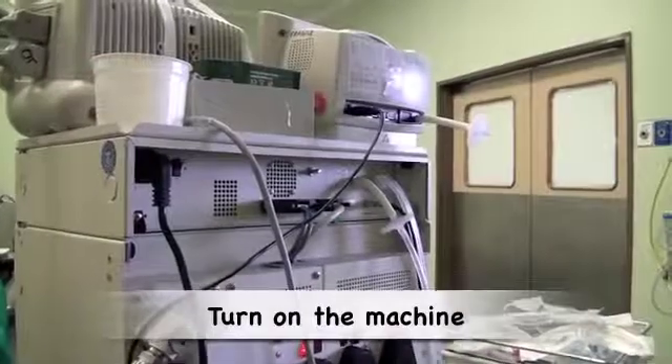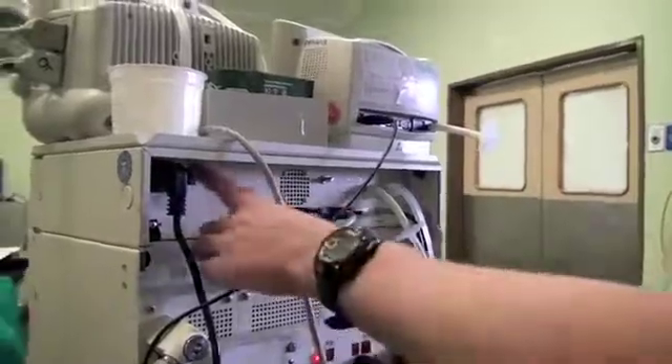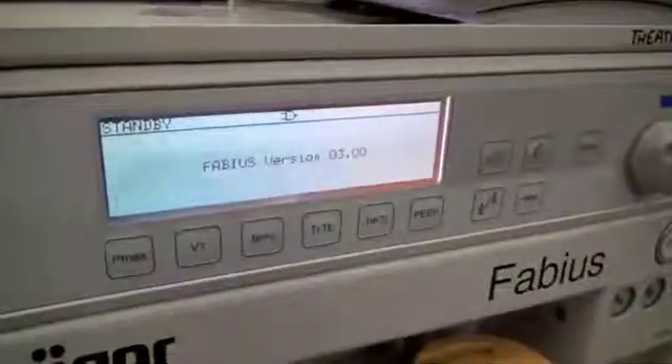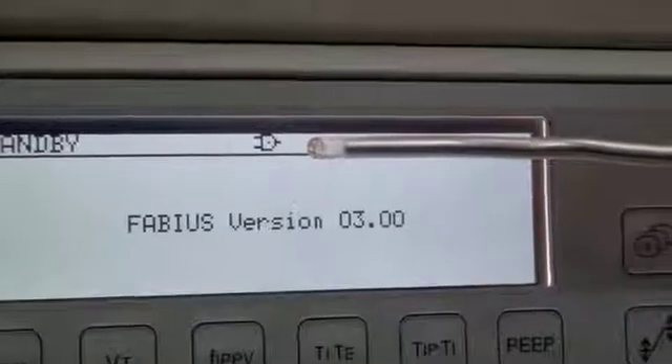Next, one needs to turn on the machine. Some anaesthetic machines have a main switch at the back of the machine; this switch on the front of the machine puts the machine into standby mode. The machine is now indicating that it is powered by the main supply.